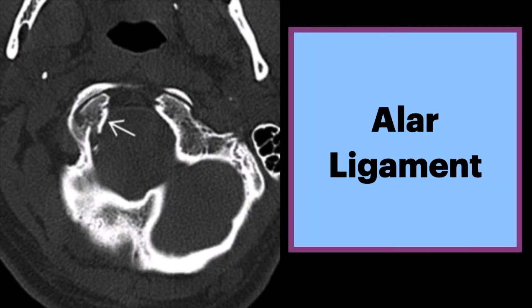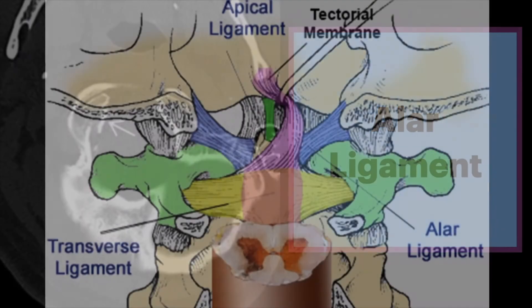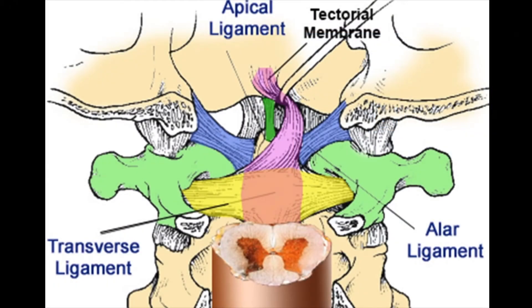This is the alar ligament. To review, the alar ligament joins the lateral margin of the dens of the C2 vertebral body to the medial aspect of the occipital condyles.